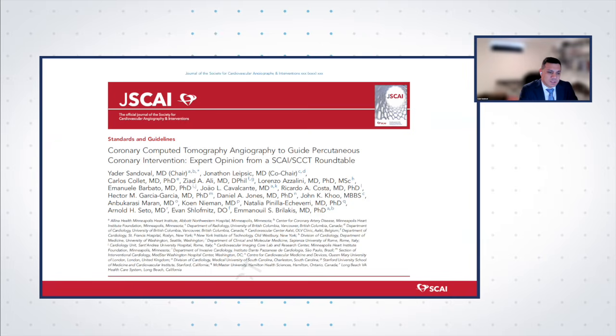As mentioned, for those of you listening, there's been a lot of interest in recent years about using CT beyond its traditional purpose of just diagnosing coronary artery disease. Can we use these images that are already being routinely acquired in patients being referred to the cath lab for pre-procedural planning? There's been a lot of interest in this. There are some pivotal trials going on. There have been a number of studies looking at different features, whether that's physiology or plaque composition, etc.